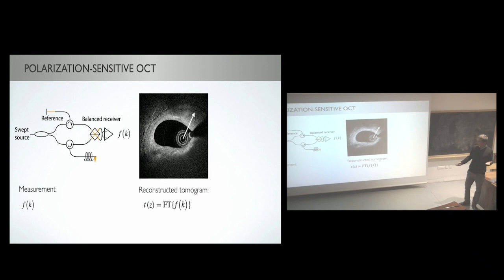Now, because we do record interference, I like to say that any OCT system is sensitive to polarization. If we have interference, only the part of the sample light that has matching polarization to your reference arm actually contributes to that interference signal. And remember that in many of these systems we have a lot of fiber, and especially in this catheter case, one detail to mention is that the catheter is rotating. So at one point in the system, you have what's called a rotary joint, where you couple the light from the static fiber into that rotating fiber. So polarization states are continuously changing.